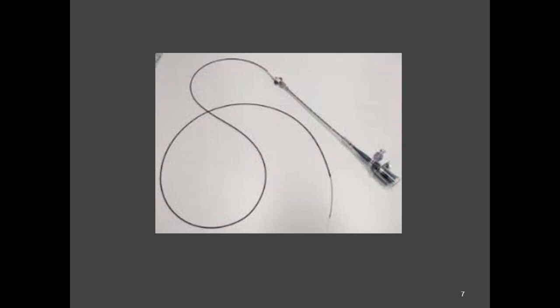So if you haven't seen one, here's basically a catheter. This one would be run through your femoral artery, and then the long flexible part, and you can see the guide in the front would then go up your leg and up into whichever part of the body they're examining.